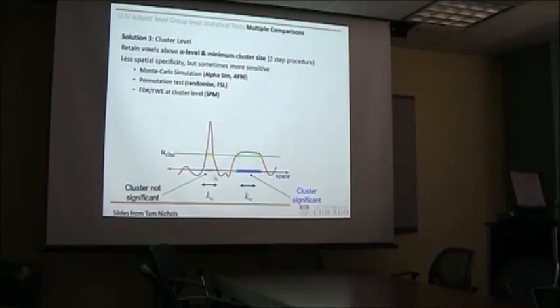And an illustration of how the cluster significance works, you can see here. So this is the same distribution of your test statistic values that I showed before. Right, so here the x-axis is some space. So you have all your voxels lined up.